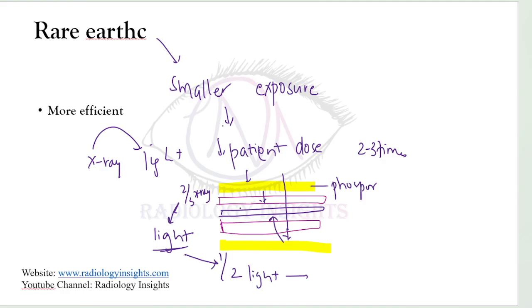The screen materials are chosen so that they do not emit delayed fluorescence, because delayed fluorescence would result in a memory of the previous exposure. On reloading the cassette, the previous image would be recorded and superimposed on the image of the subsequent exposure. So materials which emit delayed fluorescence are not selected as intensifying screens.